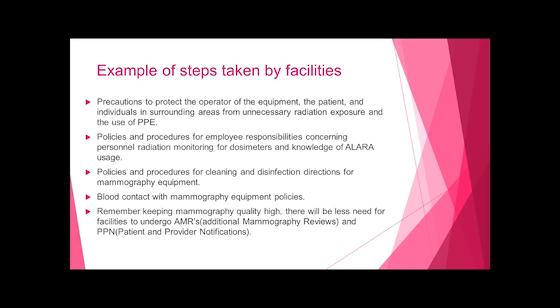Precautions to protect the operator of the equipment, the patient, and individuals in surrounding areas from unnecessary radiation exposure, and the use of PPE for your personal protection with your equipment, like thyroid shields, lead shields, face masks, things like that.